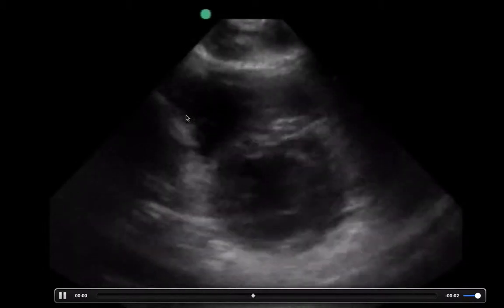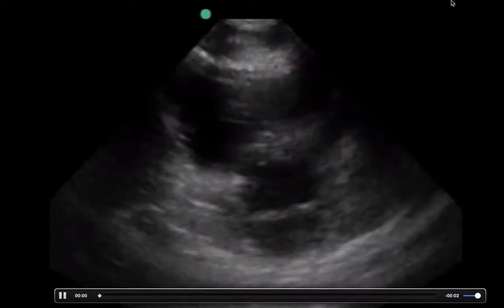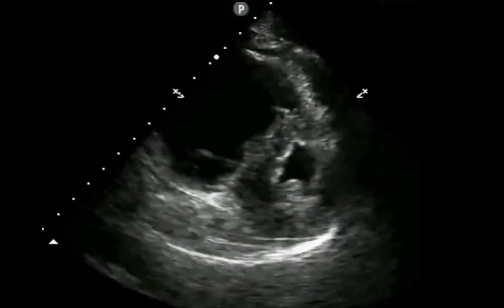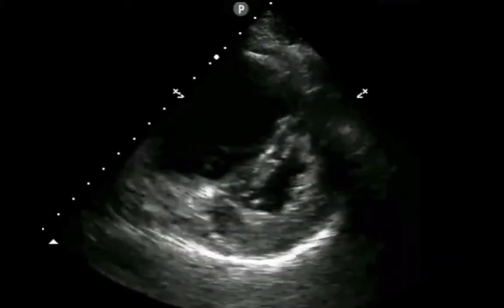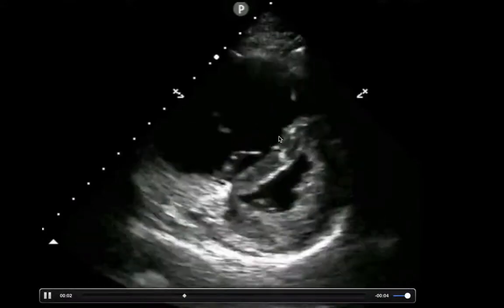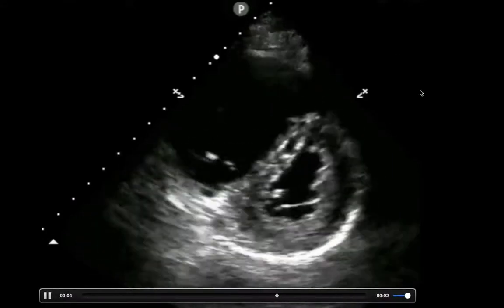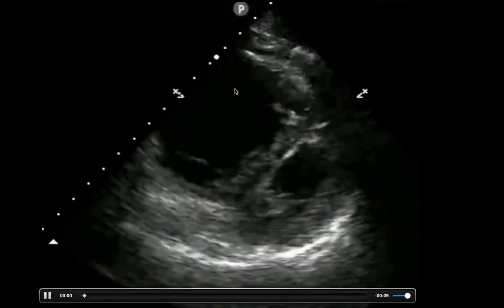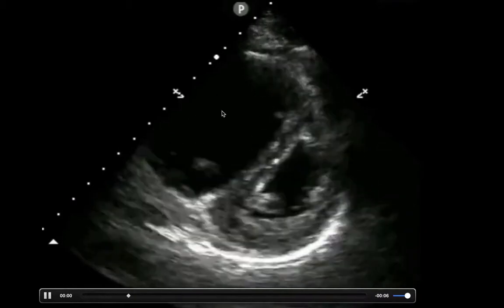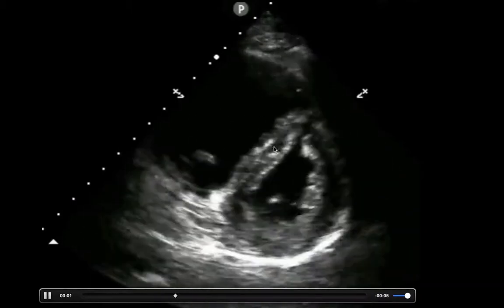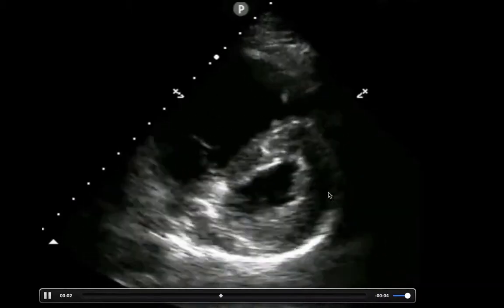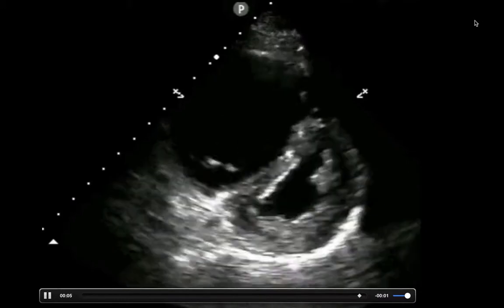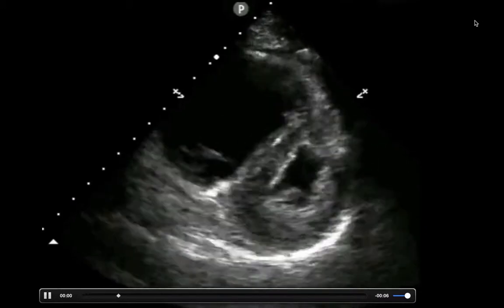The right ventricle usually kind of loops around the left ventricle. If you have an enlarged right heart, that intraventricular septum will actually bow into the left ventricle. This creates something that we like to call the D-shaped ventricle. So if you see this, think right heart strain.